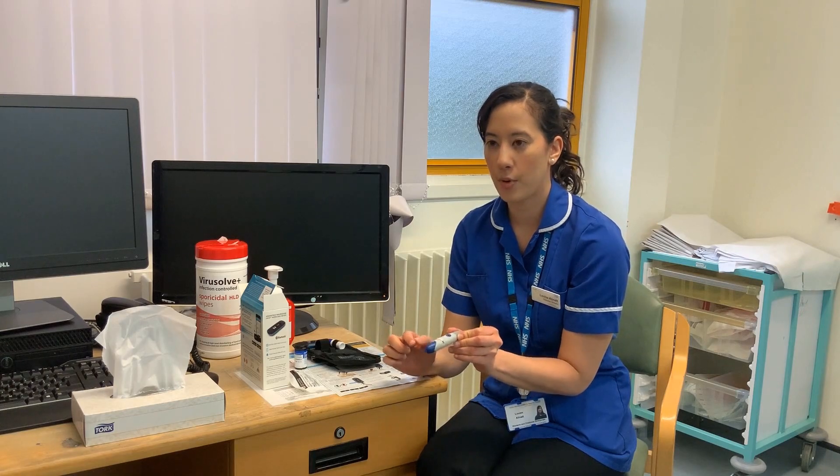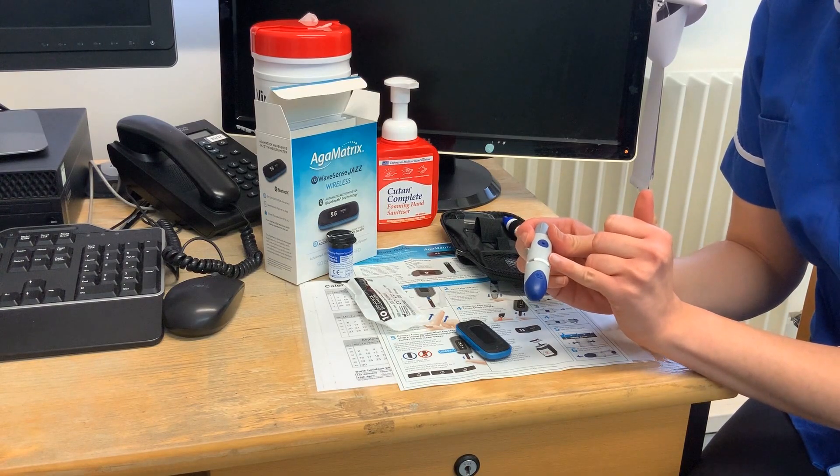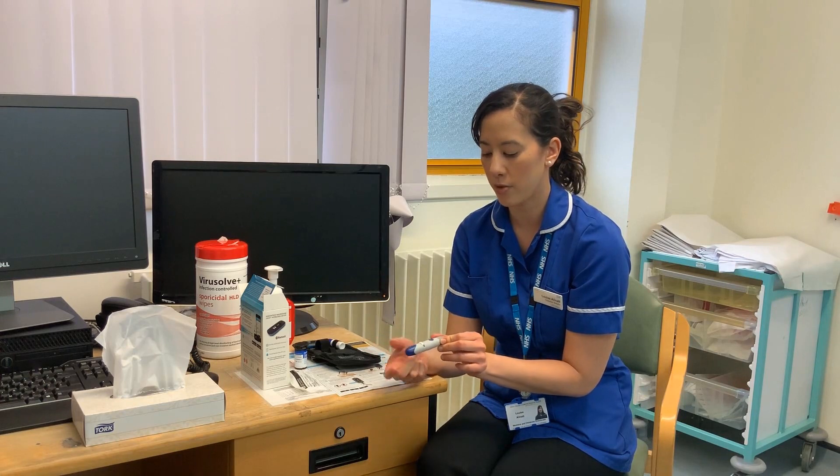The white dial here is the depth of your needle. Usually it's set to the maximum, but we normally recommend that you set it to either the second or the third dot. If you're not bleeding very easily, you can always increase that as trial and error.